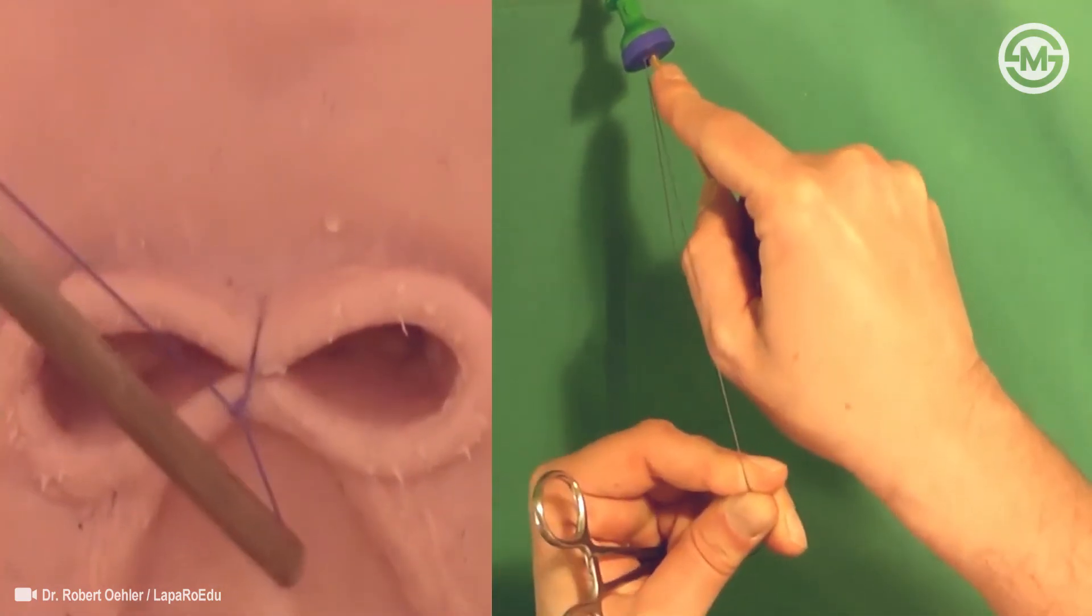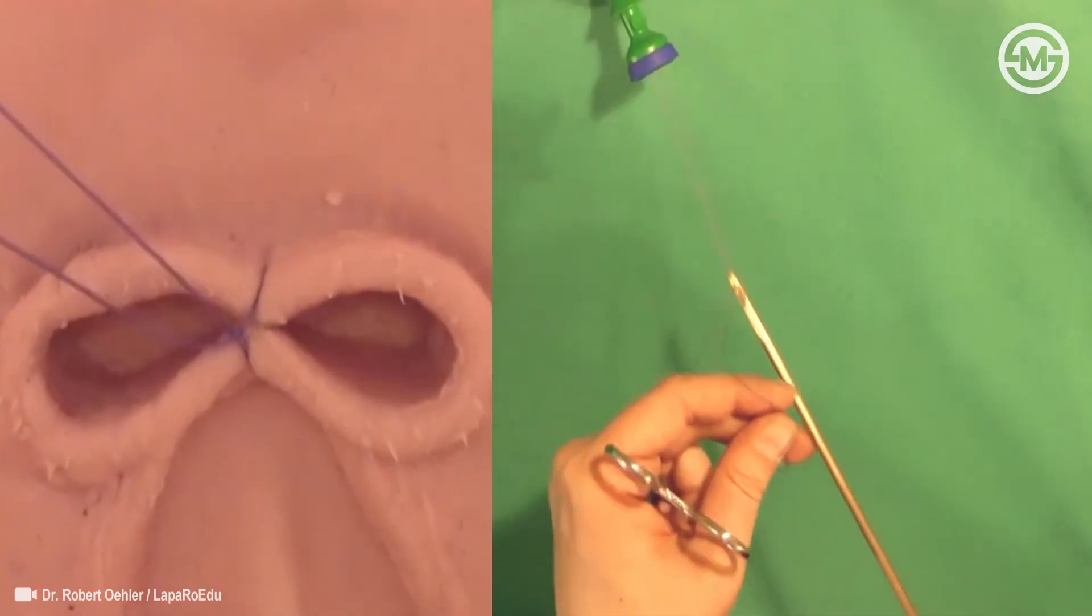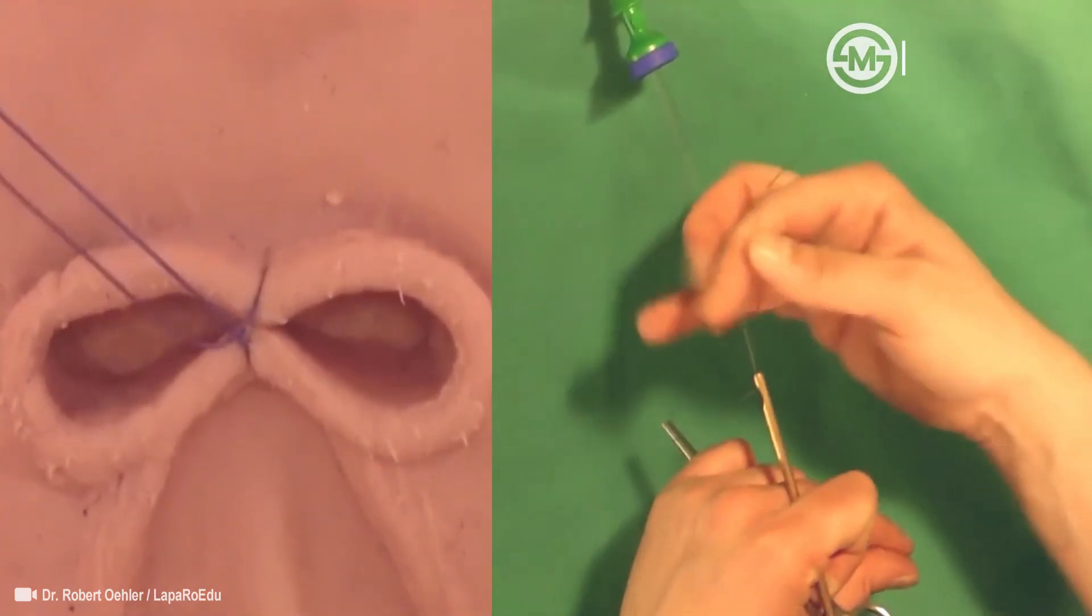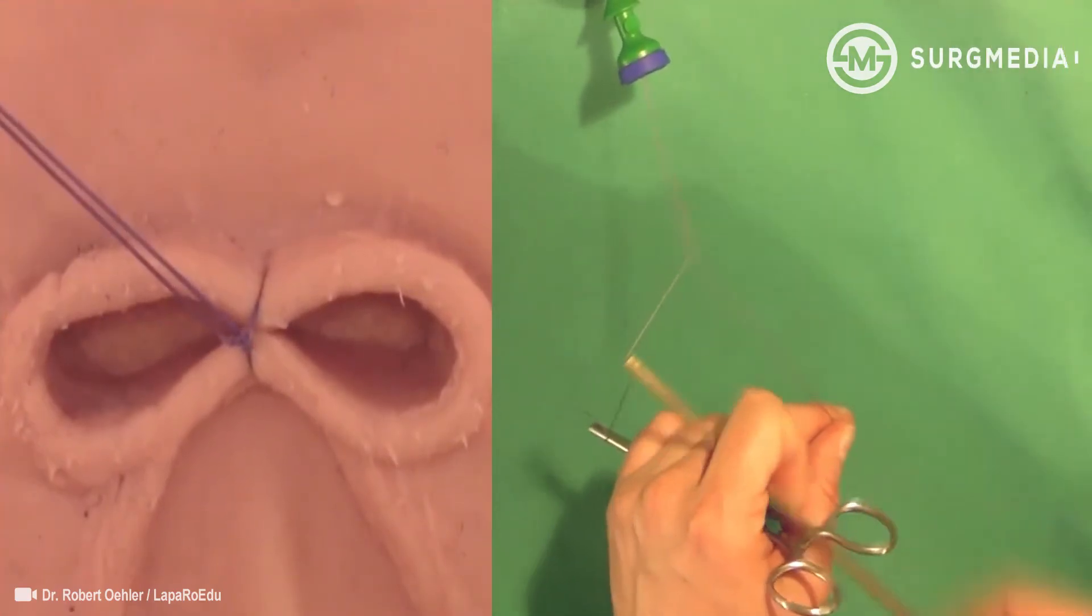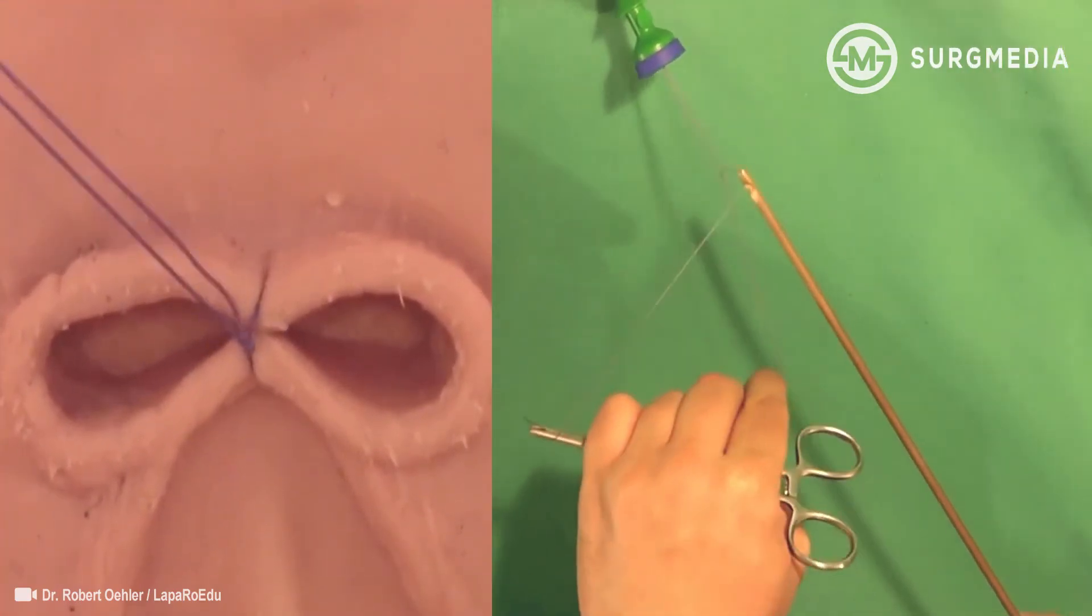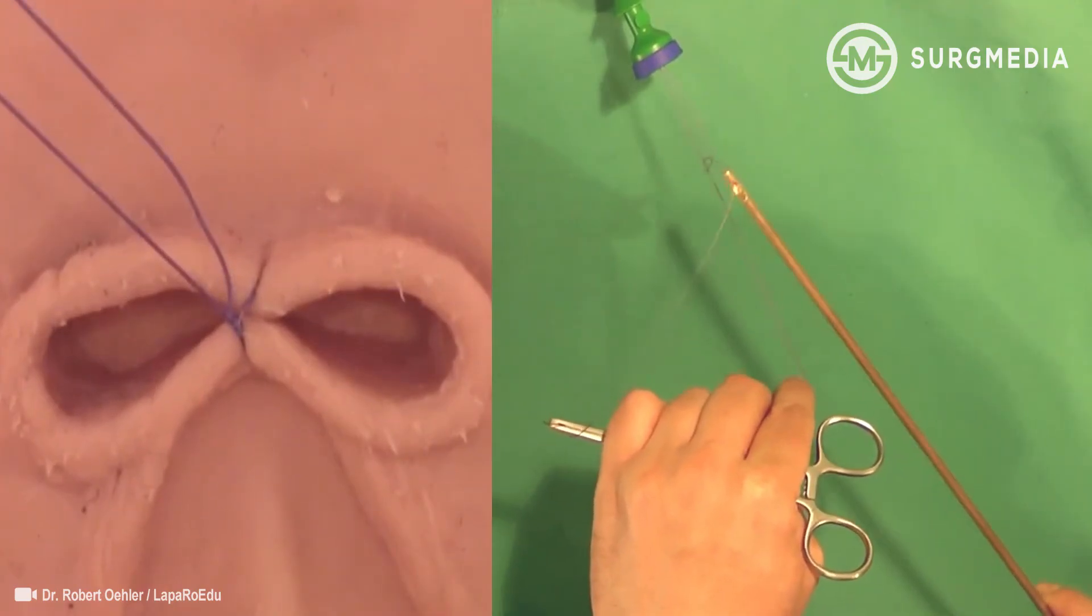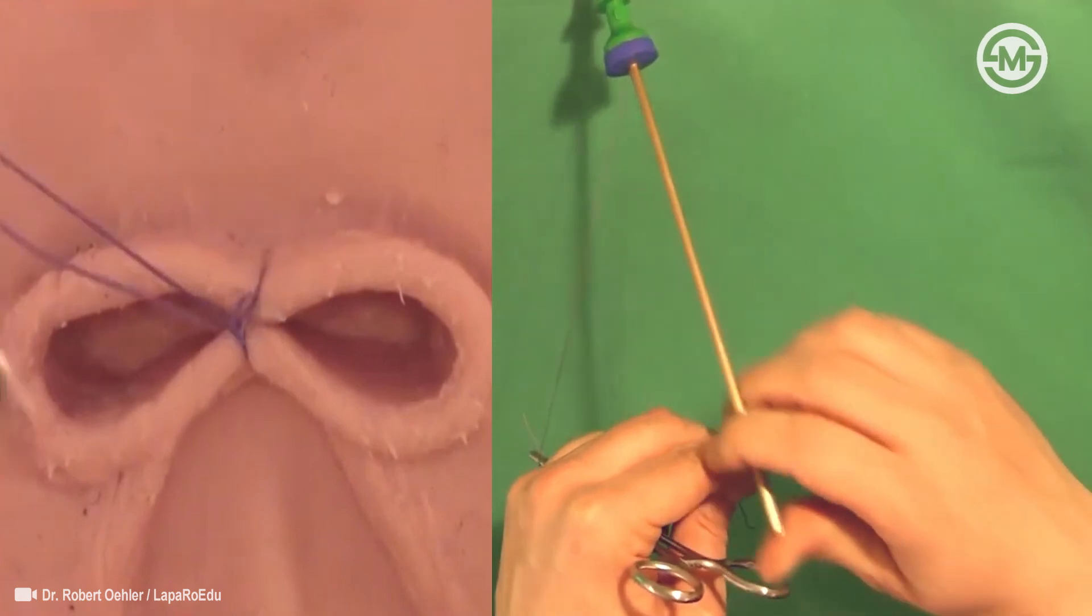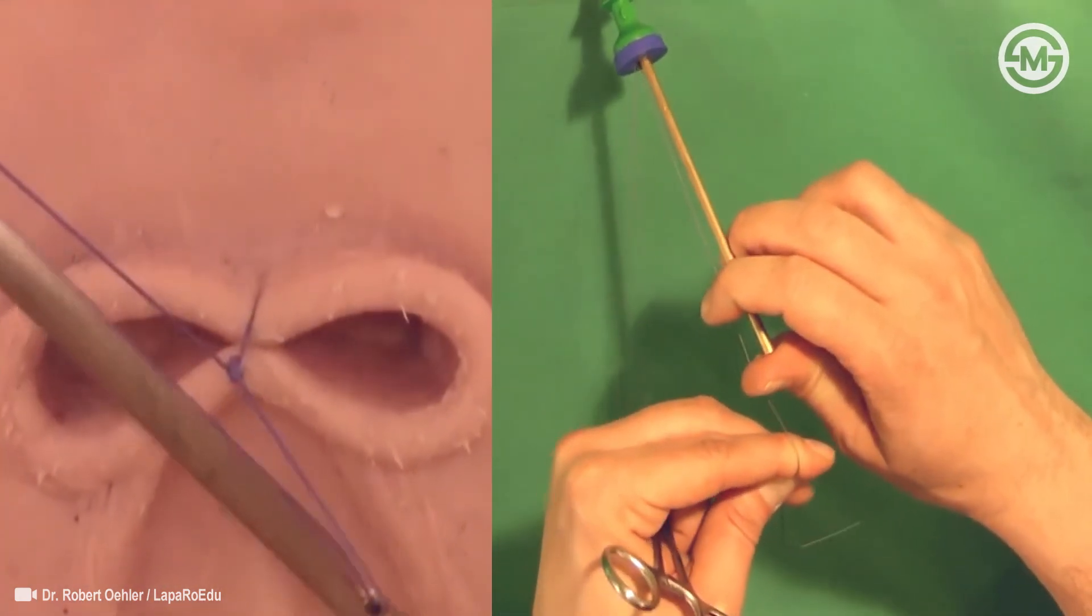Laparoscopic suturing and knot tying are two of the most difficult tasks in laparoscopic surgery. With a pelvic trainer as used here, techniques can be practiced in order to be well prepared for actual surgery. With regular practice, the improved skill will also transfer to other tasks in laparoscopy.